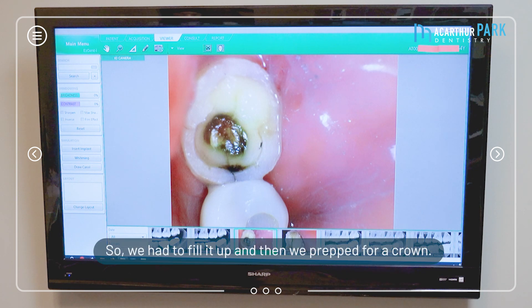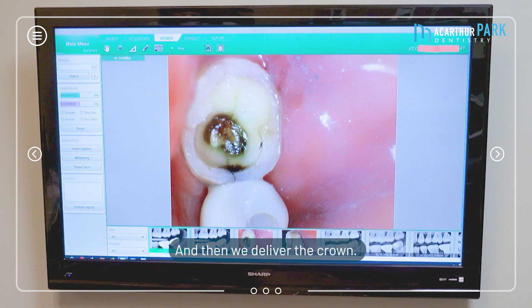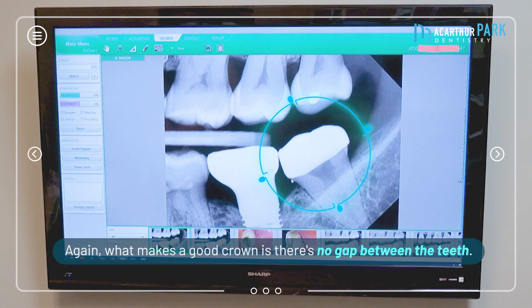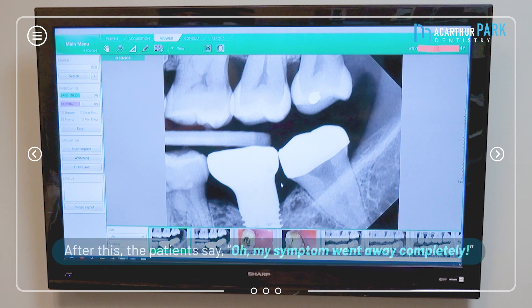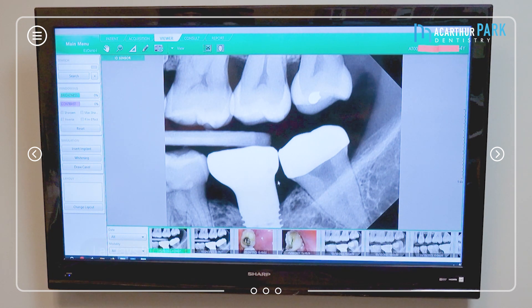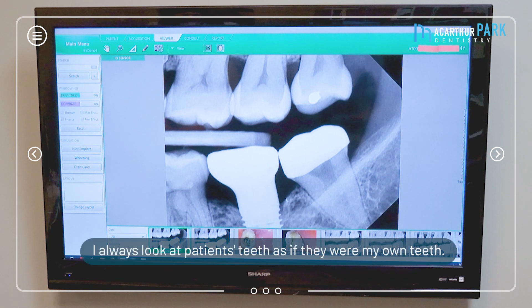After this crown is prepped, there's a big crater so we have to fill it up, then prep for crown, and then deliver the crown. What makes a good crown is there's no gap between the tooth structure and the crown. After this, the patient said her symptoms went away completely — so I think it's a successful case.